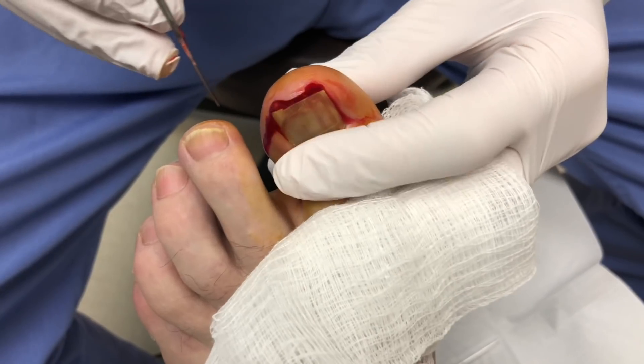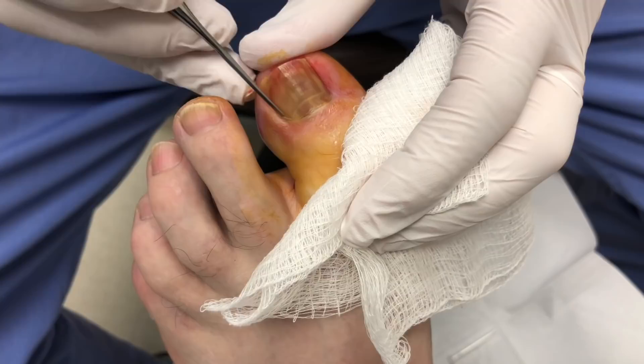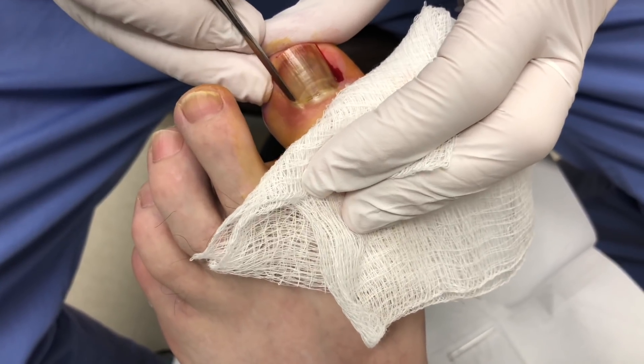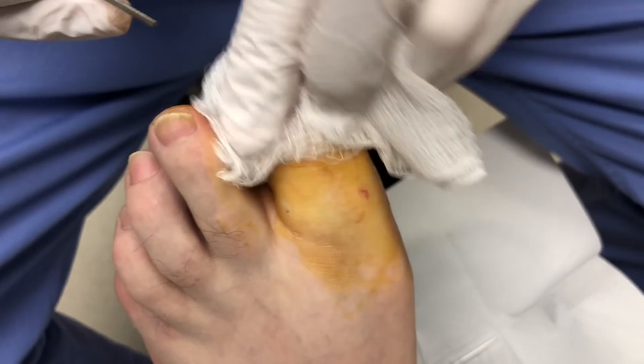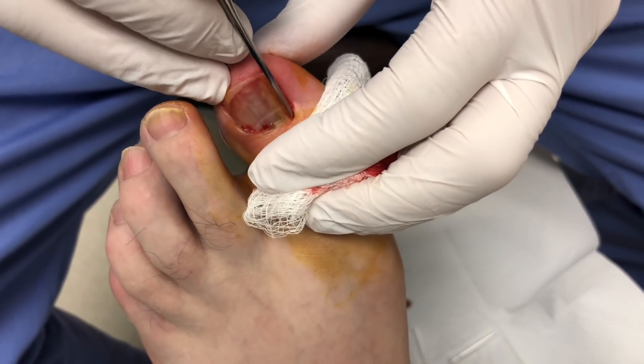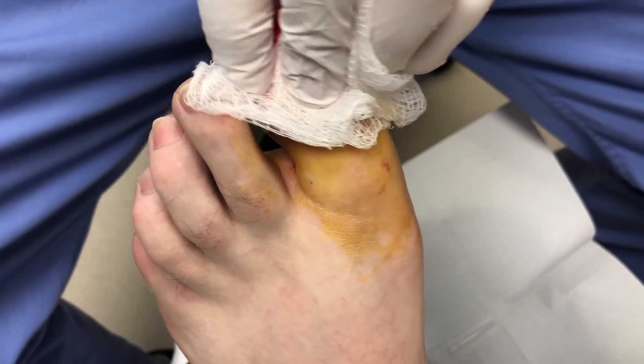You can see all this fluid that's coming out of there — that's all from catching the nail on it. It will grow back, and then he won't have to worry pain-wise anymore.